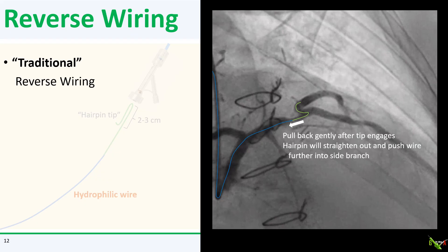Once you've engaged the ostium of the side branch, continue to pull back gently. The hairpin tip will straighten out and this will push the tip of the wire further into the side branch. You may need to torque very gently for this to happen. Once the tip of your wire is deeper into the side branch, you can start advancing the wire further forward. Occasionally, you might need a flexible microcatheter like a FineCross or a Caravel to help you, especially if the ostium of the side branch is calcified.